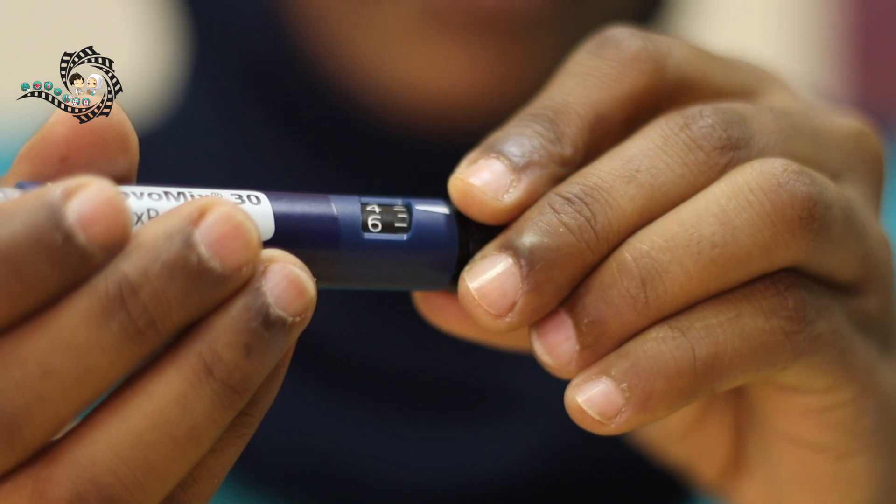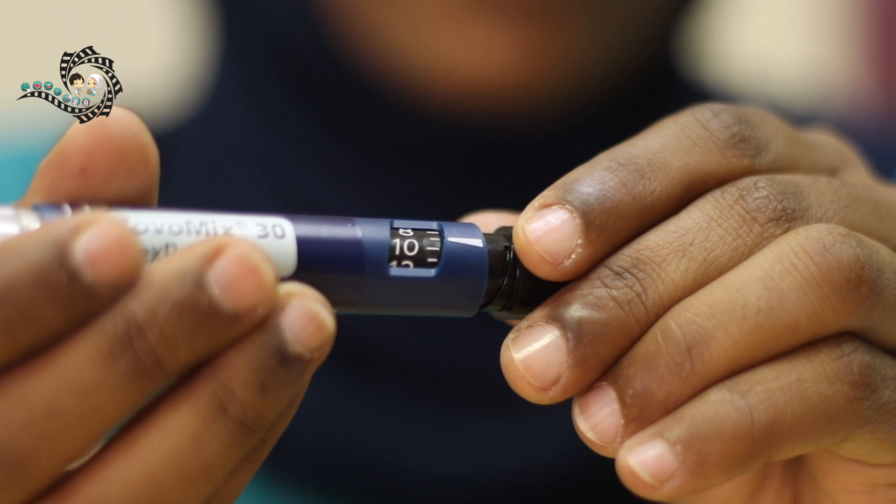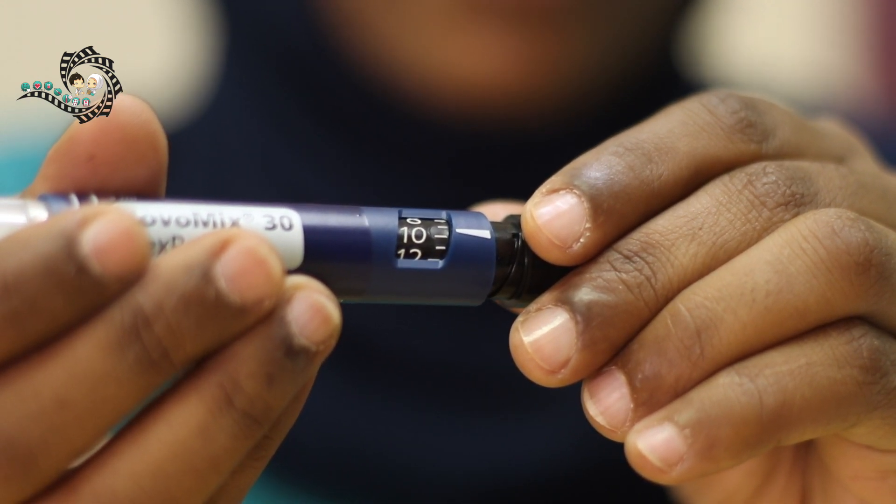Step 4: Select the dose. To select the dose, turn the dose adjustment knob to dial the appropriate dose that you want. In this example, we will be injecting 10 units of insulin.